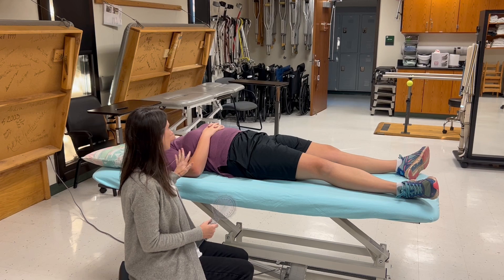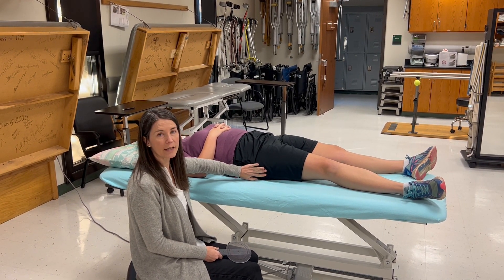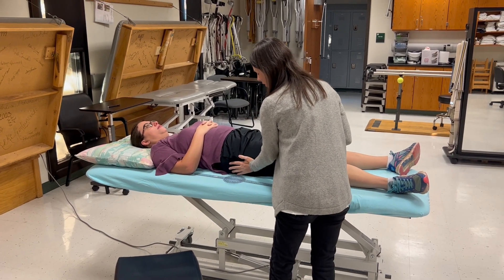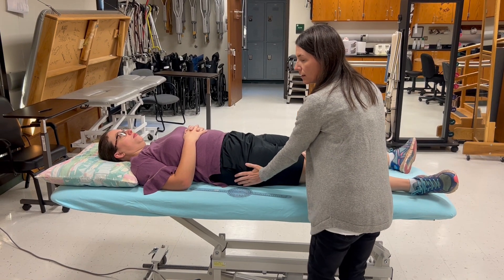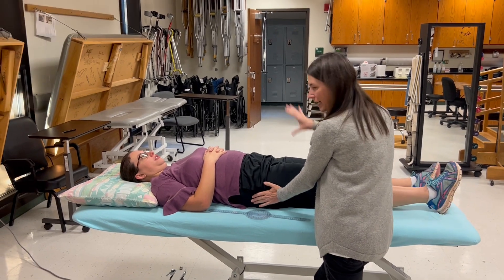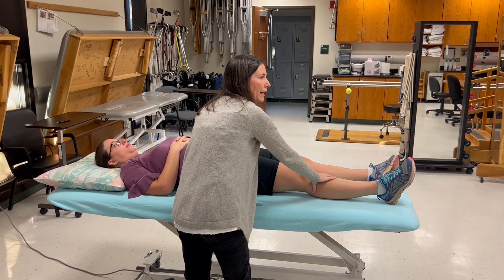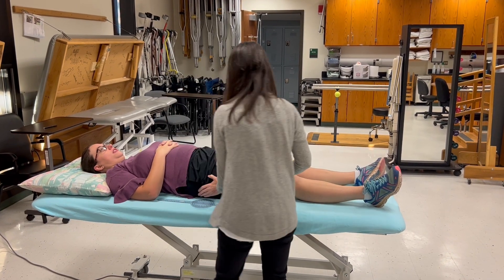The standard testing position is the patient in supine. We start by palpating the greater trochanter because that's where the fulcrum of the goniometer is going to be lined up with. I'm going to place my hand along the lateral, slightly posterior side of the hip. When giving tactile cues for rotation, my hand has to be proximal to the knee — not distal — so I don't introduce a rotational movement into the knee.